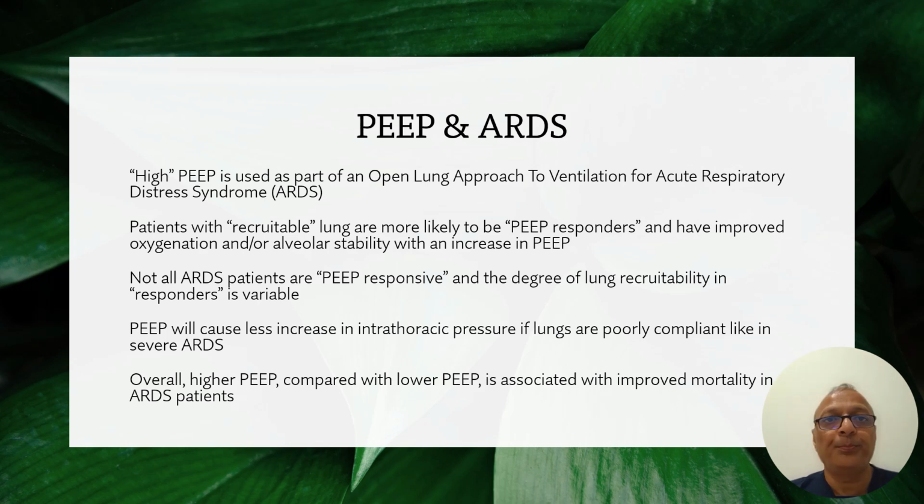Regarding the use of PEEP in ARDS patients, high PEEP is used as part of an open lung approach to ventilation for acute respiratory distress syndrome. Patients with recruitable lung are more likely to be PEEP responders and have improved oxygenation and or alveolar stability with an increase in PEEP.